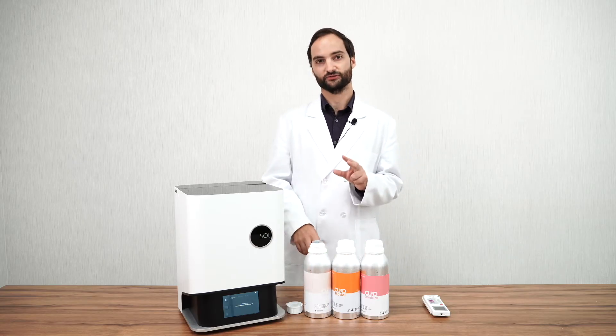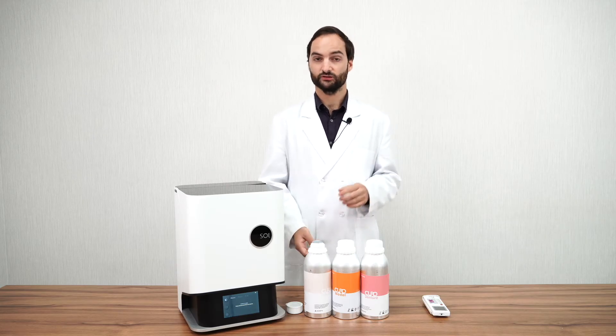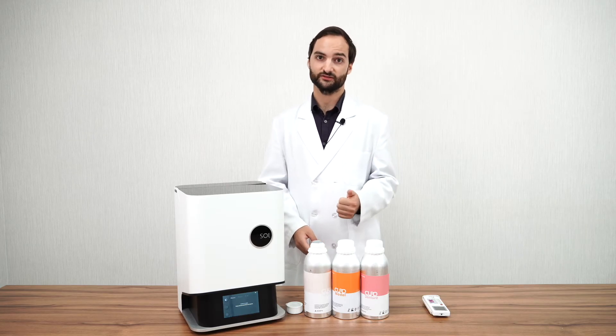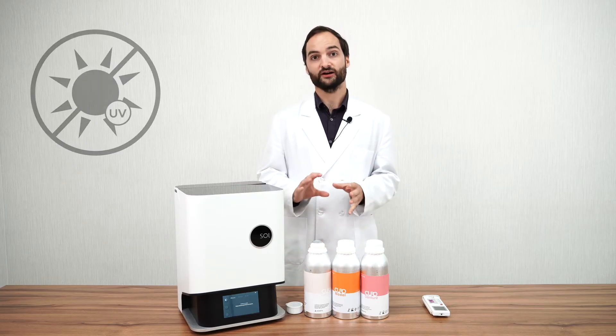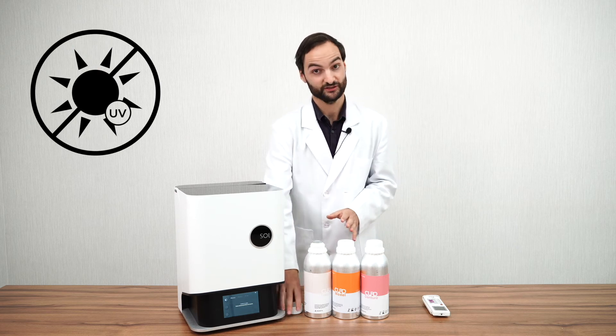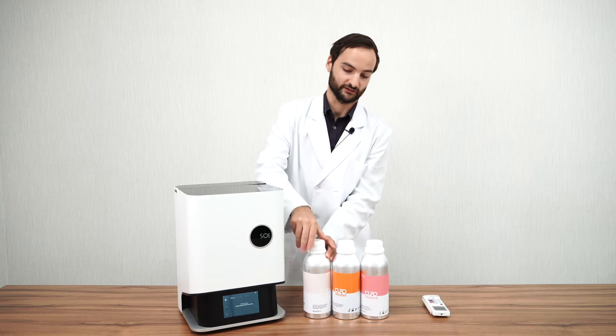There are three factors that can alter the consistency of your resin. The first one is UV light, the second one is temperature, and the third one is humidity. As far as UV light goes, you simply need to make sure your bottle is closed, and then it's safe.